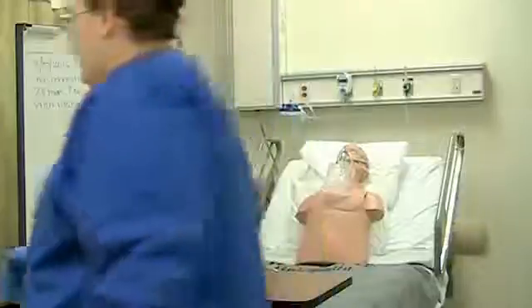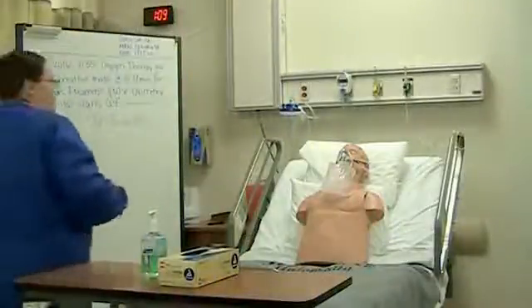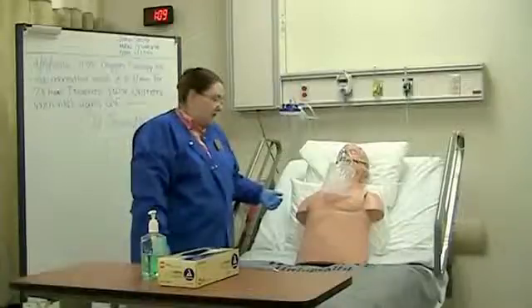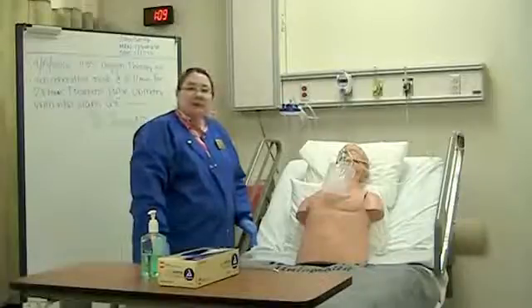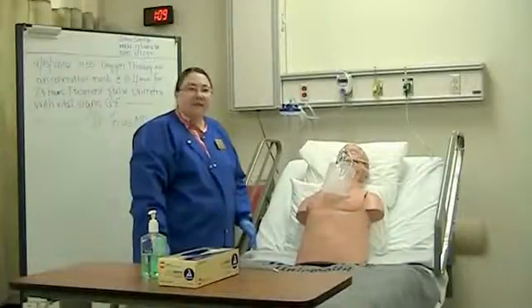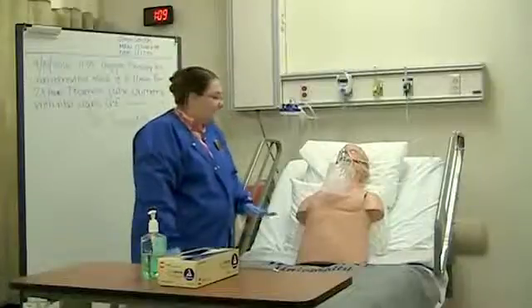Now that the mask is on, I will complete a follow-up assessment, which will include the heart rate, respiratory rate, and also a pulse ox to make sure that my patient has adequate oxygenation before I leave the room. After I'm finished with this, I will restore the room.